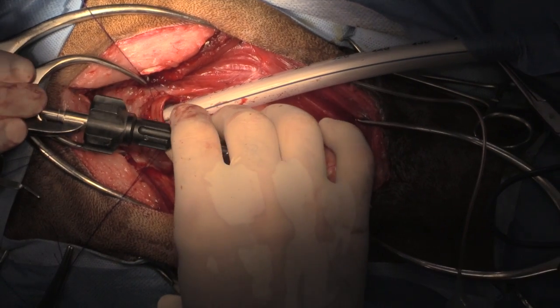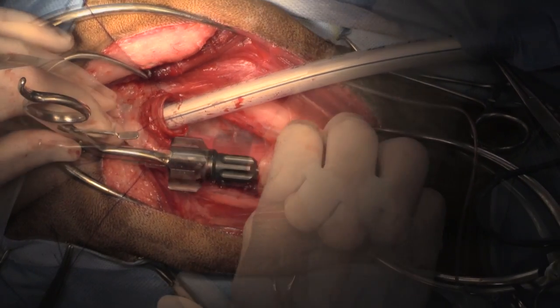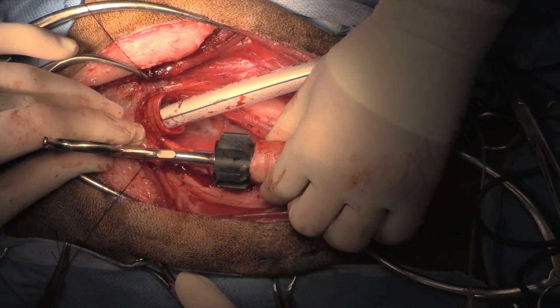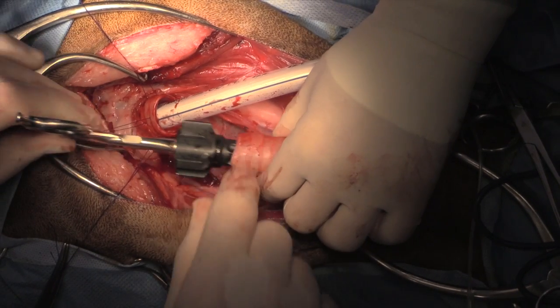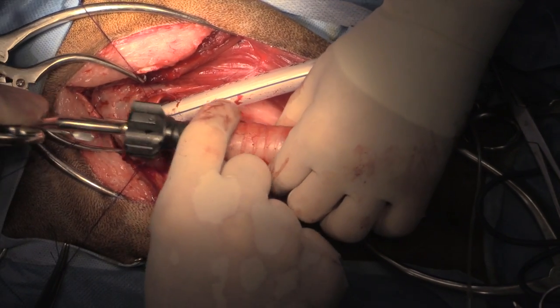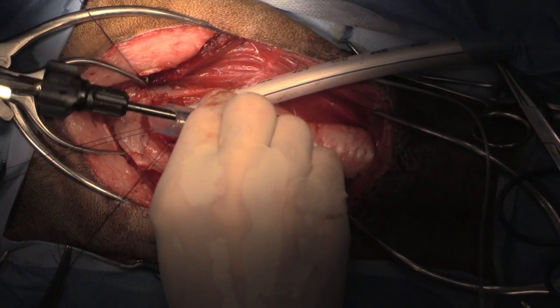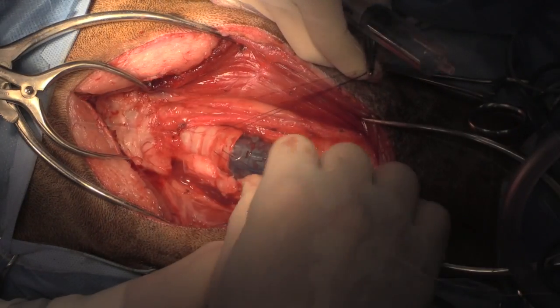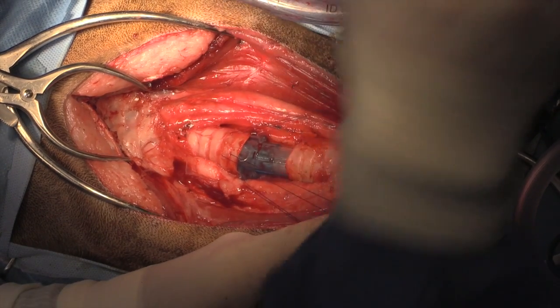This allowed the old endotracheal tube to be removed and a new one to be placed over the laparoscopic grasping instrument, directing it down the trachea without having to re-intubate in a conventional fashion.